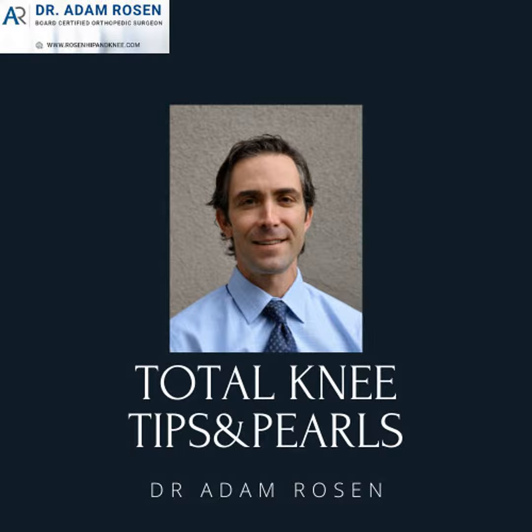Once you've done the medial side, I remove those retractors and then move on to the lateral side. And again, a lot of times this can be quite tight. So one of the tricks, and I'll talk specifically about how to do it later, is if you have trouble seeing the lateral side as part of that soft tissue release, you can take the polyethylene insert out now. And we'll talk about specifically how to do that in the next section.